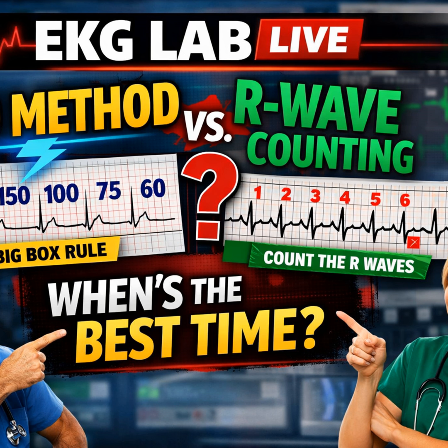MAT is a distinct entity, yes. The source mentions it with COPD. Right, the 78-year-old with lung disease. MAT is defined by irregularity. If you just zoom in with your big box calipers, you miss that variability. You might just call it sinus tach and treat it completely wrong. The strip method forces you to see the rhythm as a whole.